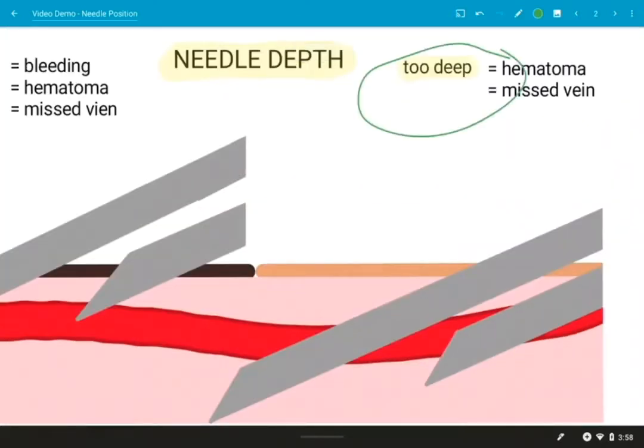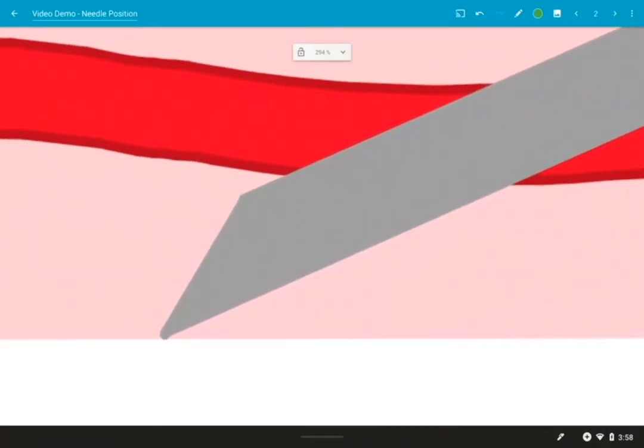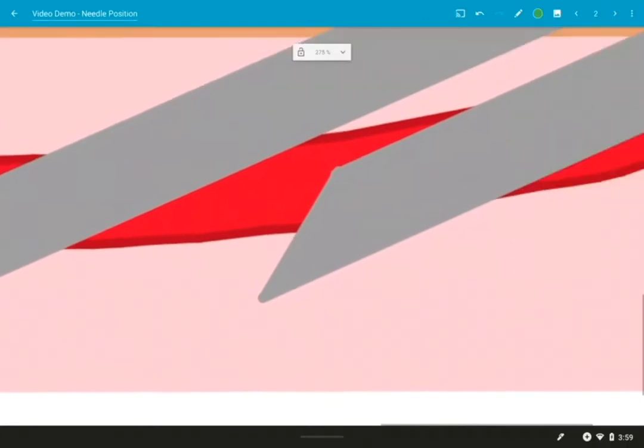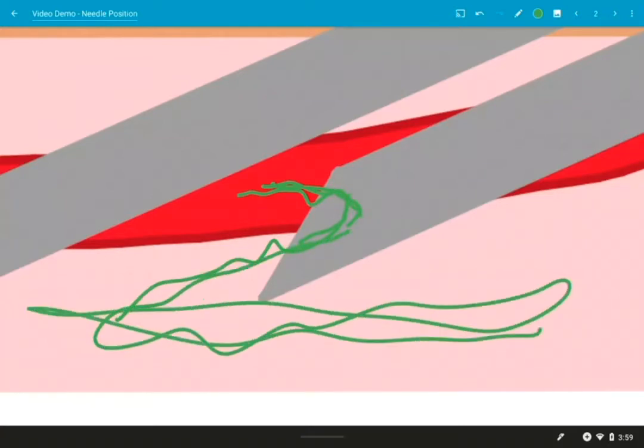All right. And if you enter too deeply, you can cause a hematoma and a missed vein. You'll miss your vein if you go completely through the vessel because there's just no opening right here for the blood to go into. If you go in a little bit less deep, but still too deep, you're going to have part of your bevel in the vein, part of your bevel in the tissue. And just like the too shallow example, it will flow into the bevel and out into the tissue and cause a deeper bruise.